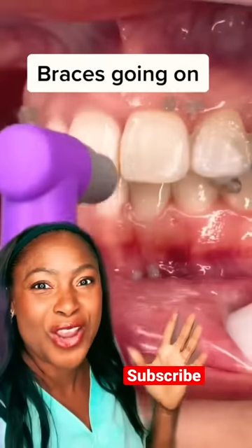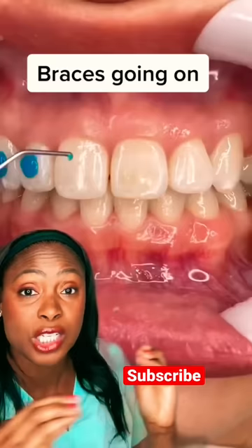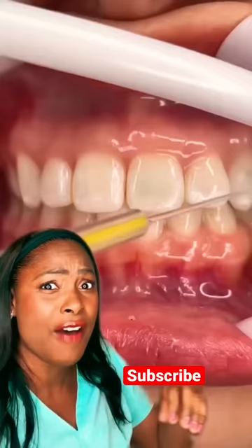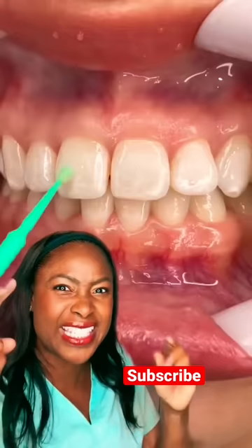Braces going on for the first time. They clean the surface of the teeth with what we call a pumice and then wash that off. You can see an acid etch that they're placing on the teeth. This etch is then suctioned off, washed, and blow dried. You can see a nice chalky appearance — that's a good etch.